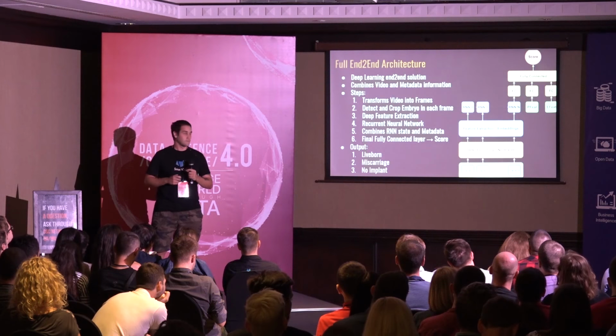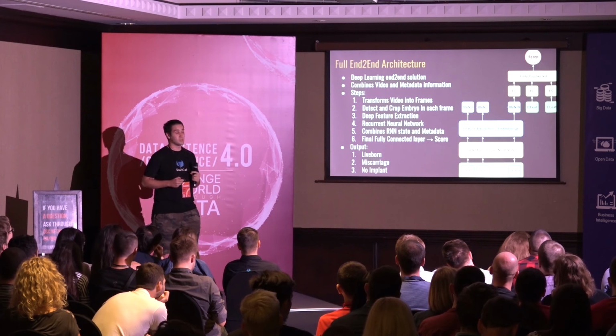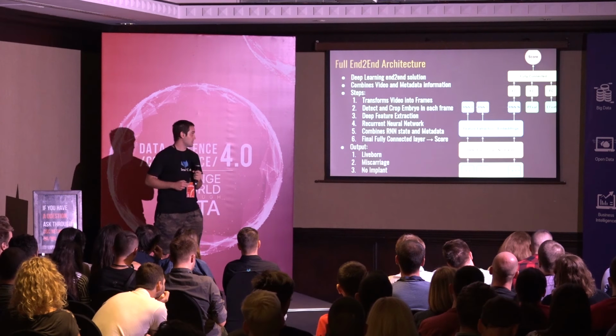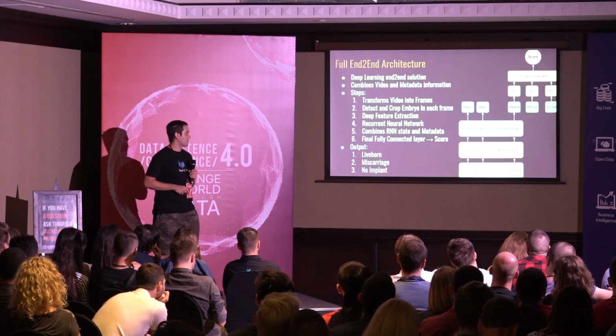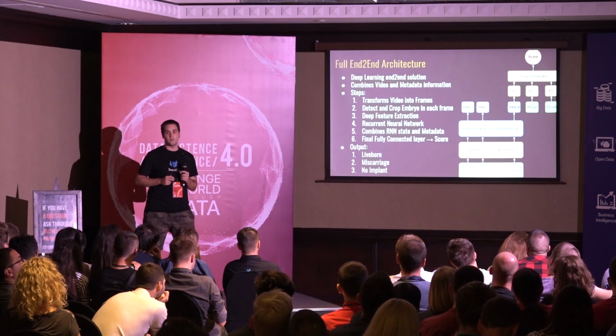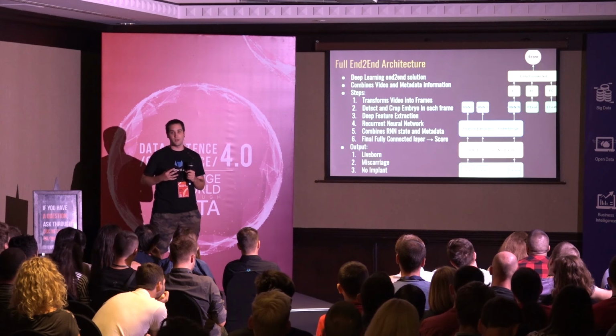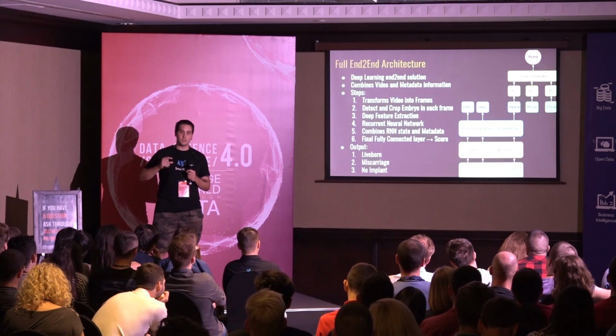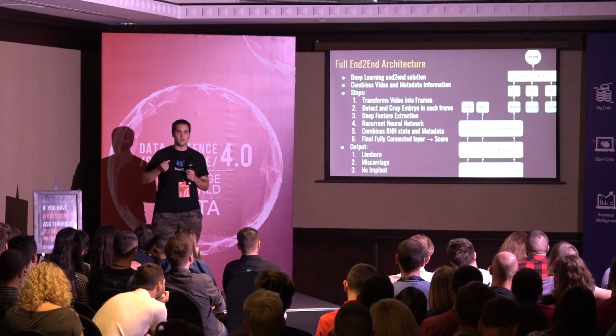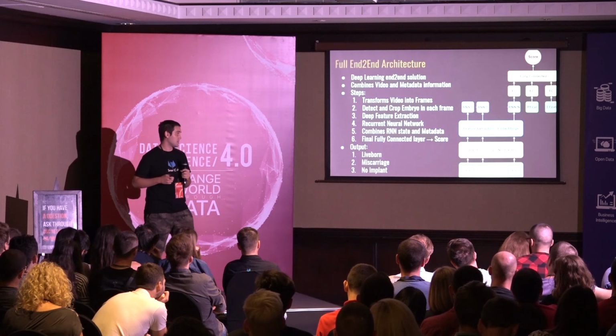This is the architecture that we used in this project. As input it takes a video of the first 5 days of embryo development. That is a time-lapse video, and every image is shot after 20 minutes, I think.